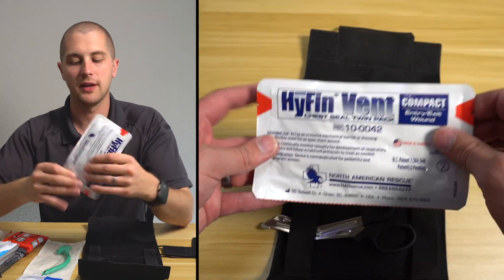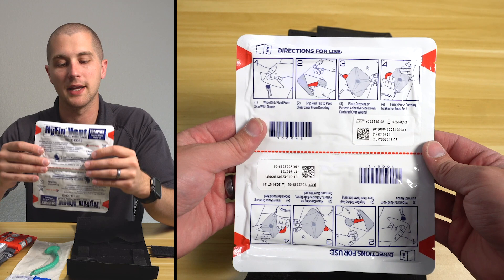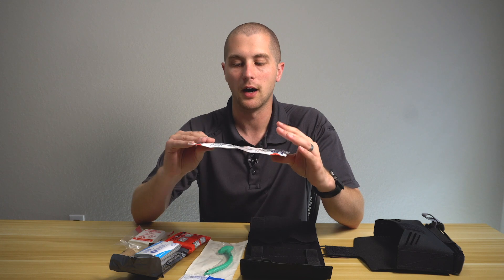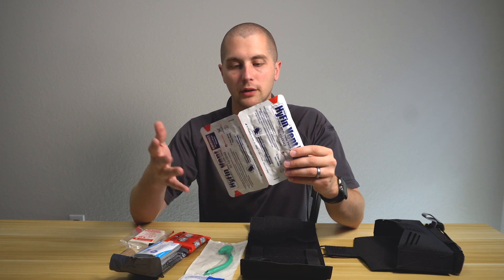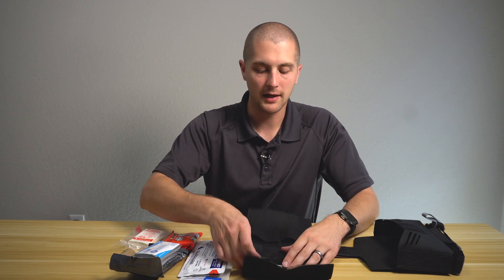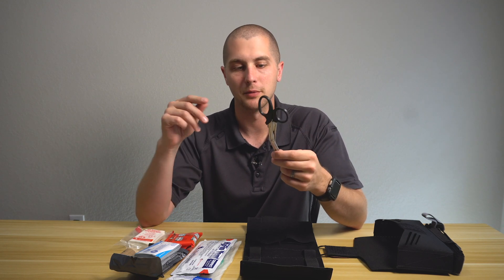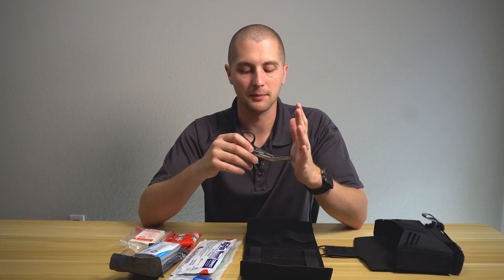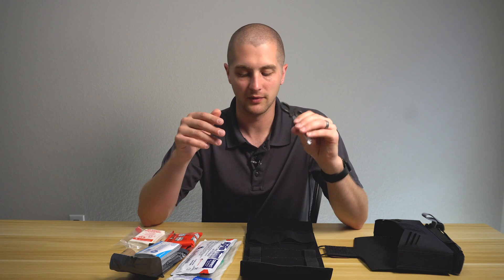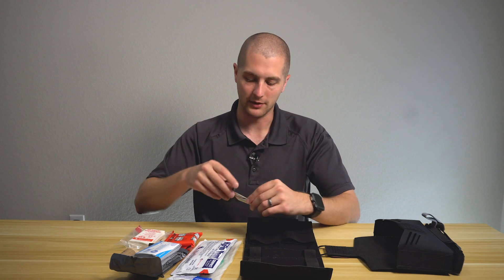Below that, you have a Hyfin Vent chest seal, and this is a twin pack. These are vented chest seals from North American Rescue, and it comes with two for an entrance and an exit wound — a good occlusive dressing. I really like that that's in there and that you have two of them. And then last but not least, down below that, you have a small pair of trauma shears. I'm going to be carrying my own — either my Raptors or my X shears — but if you need something in this kit, this will hold these just fine. I'll probably take them out to save a little space since I'll have my scissors mounted on the outside.